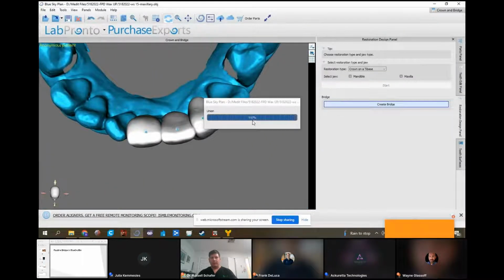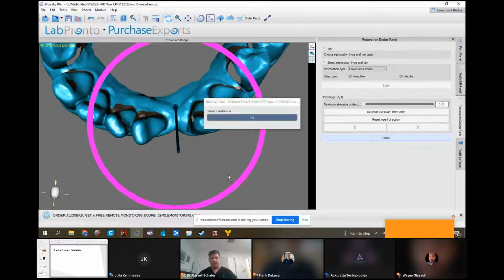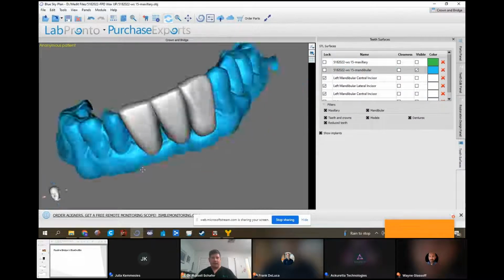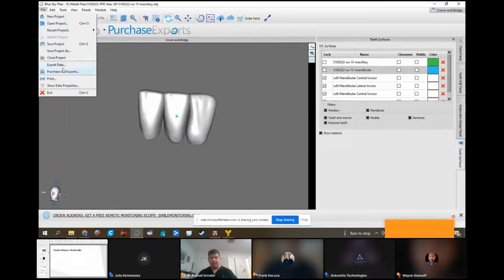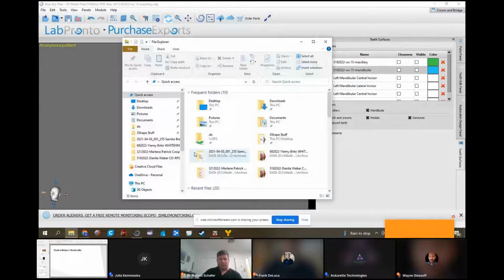Next, I'm trying to bulk up the connections, the connectors, just so that I have enough room. Now we try to get a path of draw. And from there, I've got a bridge. In my mind, this thing took me maybe 15 minutes to do, or maybe 10 minutes. For new people, it would probably take about half an hour to do your first one, maybe an hour at most. But next slide.